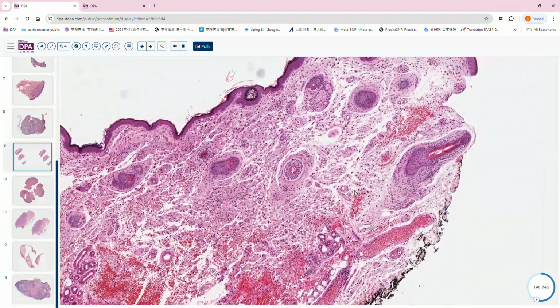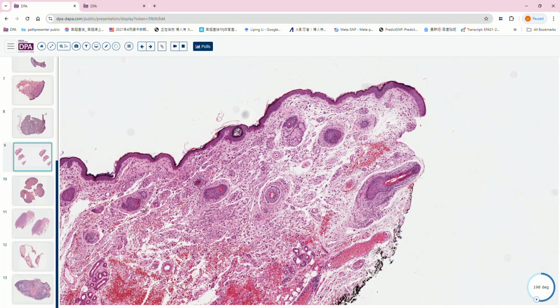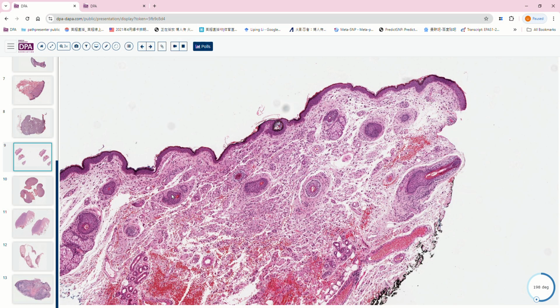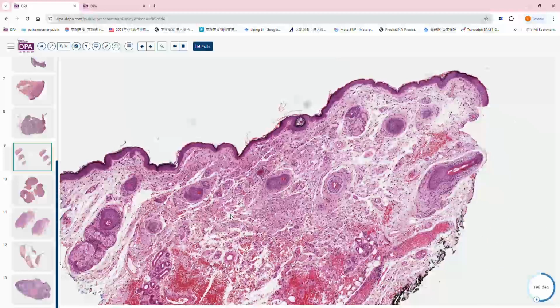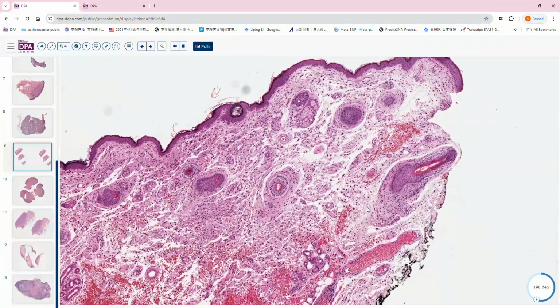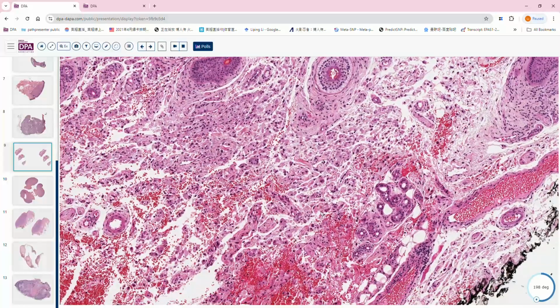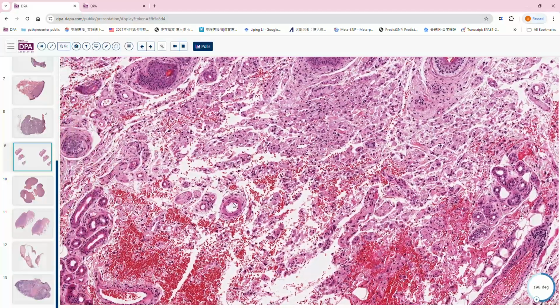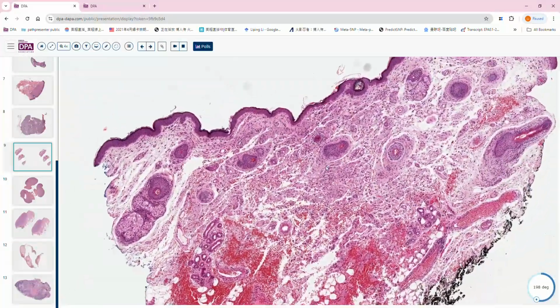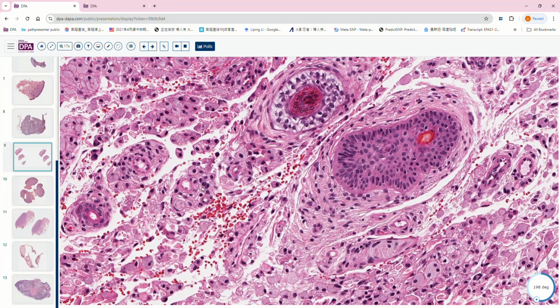And then another feature is that we have tons of these small follicles. They do not go really deep. So there are kind of vellus hair-like follicles. That is another clue that we are in the eyelid. And then sometimes we can also see some skeletal muscle there, but this one is not that dramatic. So when we tell the location and combine it with these xanthoma cells forming sheets, this is Xanthelasma.